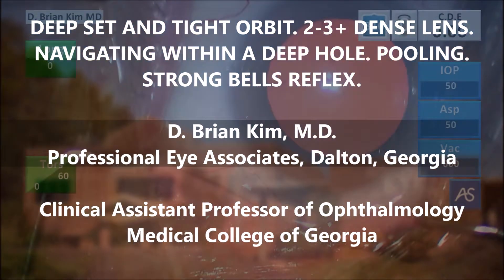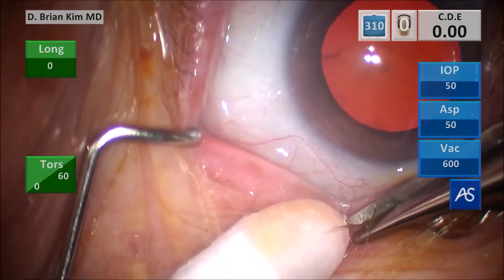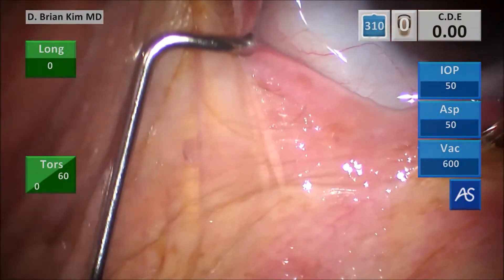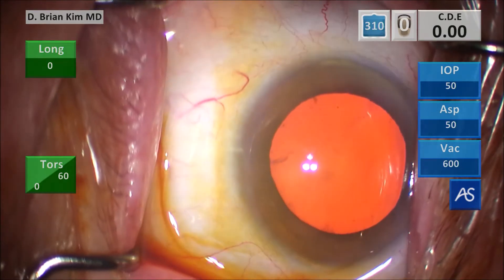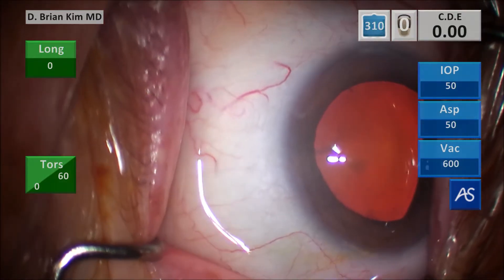First things first, this patient has some lashes that are exposed. I really don't like any lashes. We use Tegaderm when we drape our patients, so I snip those lashes, and then we're going to put some more Betadine on the eye for extra assurance that we're killing any germs on the ocular surface. You can see there's a lot of pooling, and again, this is because this patient is very deep set.